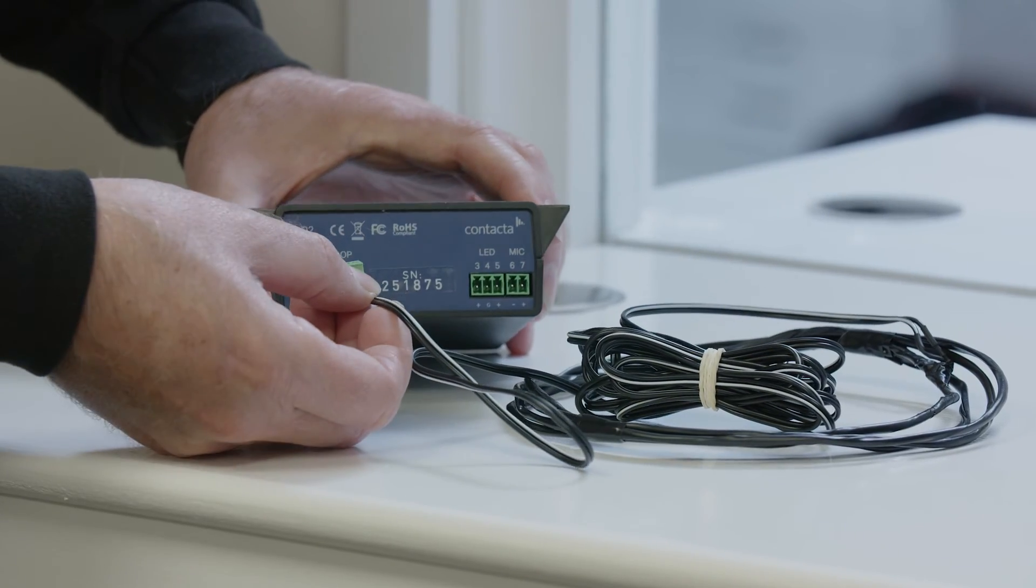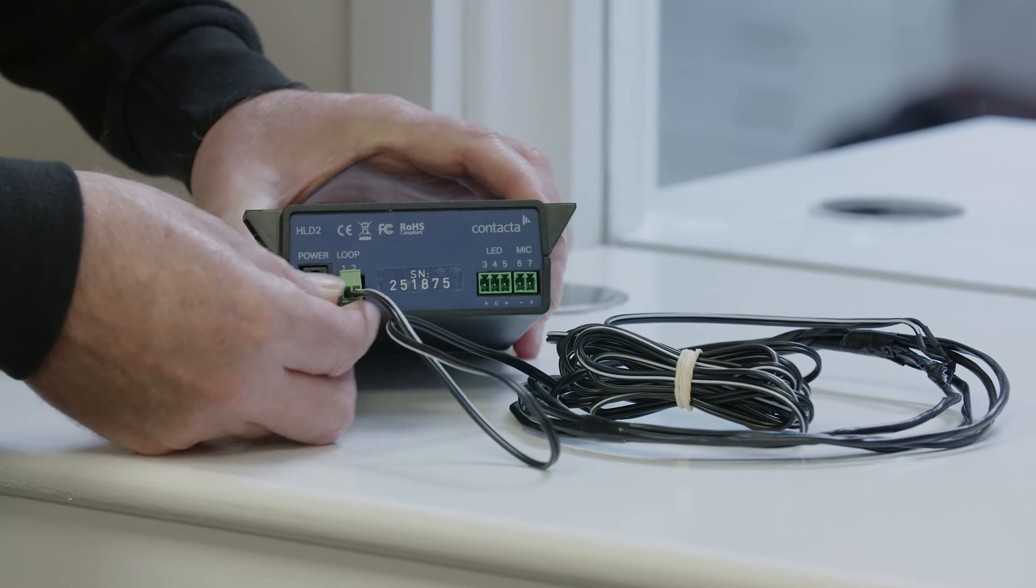Connect the hearing loop plug into the loop sockets labeled 1 and 2 at the rear of the HLD2 driver.